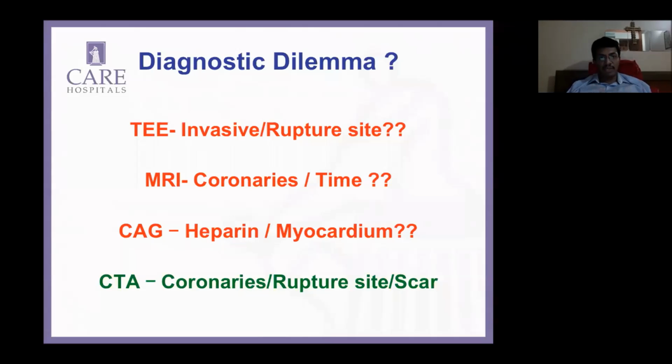I never get to see the coronaries. I was doing coronaries on MRI about 5 years ago, and for the last 5 years, I really don't even look at it anymore because it just takes so long, and CT is just seconds away for us. So MR again ruled out.